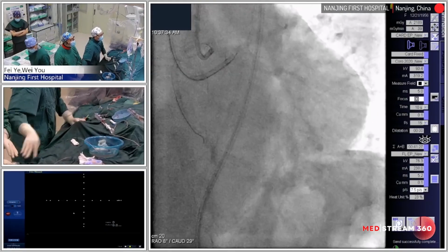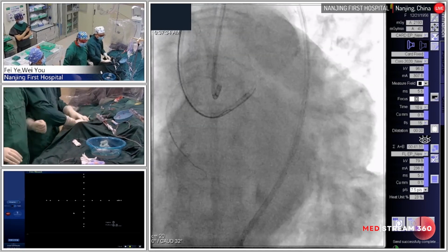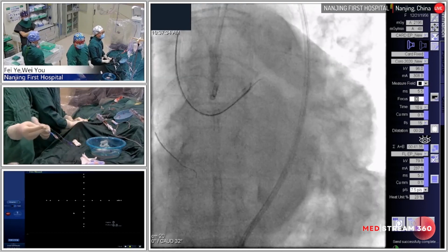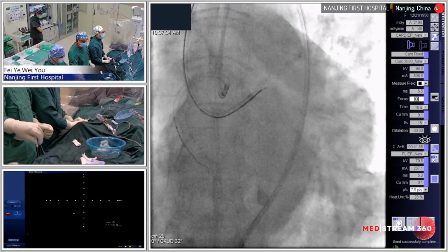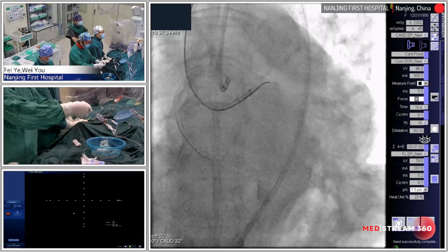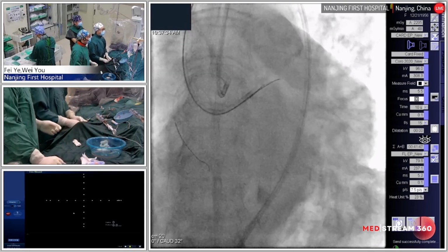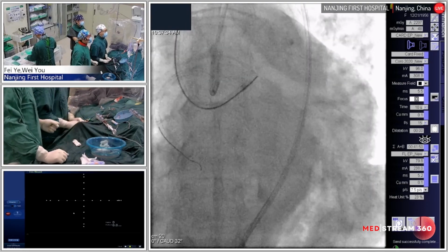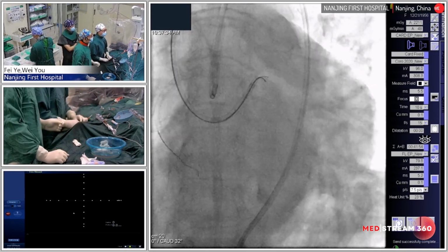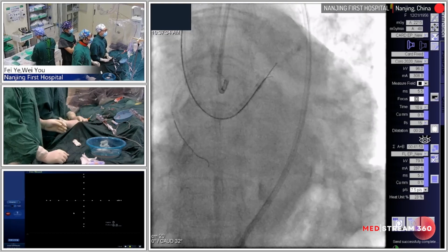Yeah. Because you should first make the wire in the LAD proximal. There is a marker. So use a single lumen microcatheter. Single lumen catheter, I think so. So you don't need to use two wires in the LAD. Which kind of wire? Because just when I wanted to retrieve the KDL, it bit so strongly that I lost my wire position. Okay. Yeah, now I just want to deliver.